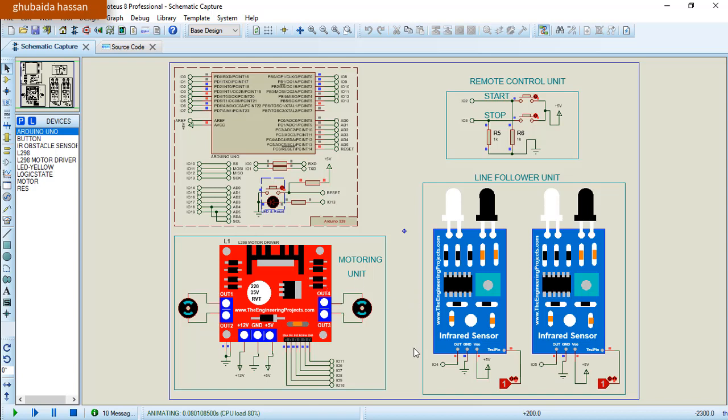Now, as long as we need the line follow unit to be active all the time, I will try to shut down one of the IR sensors and then try to start the wheelchair here. So there will be nothing out of this output pin of the IR module. So if I try to start the wheelchair, it's not going to run. Okay, now let us give it some amount of voltage. Okay, and let's start our wheelchair.